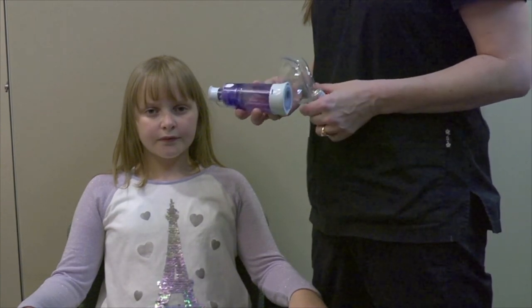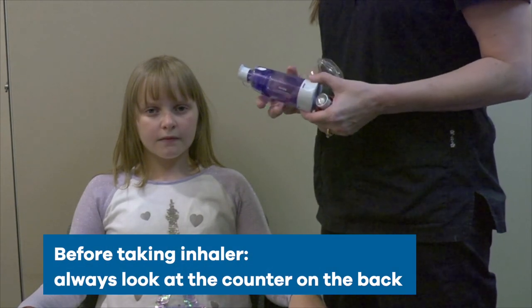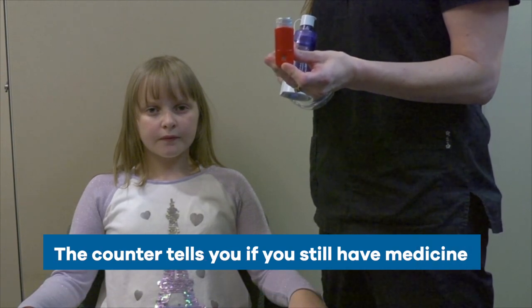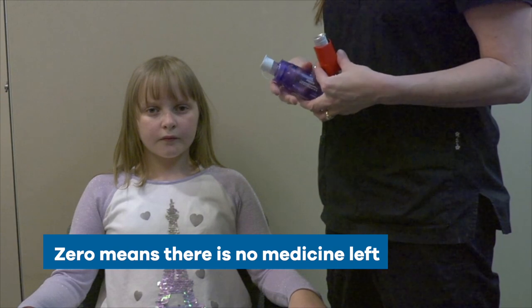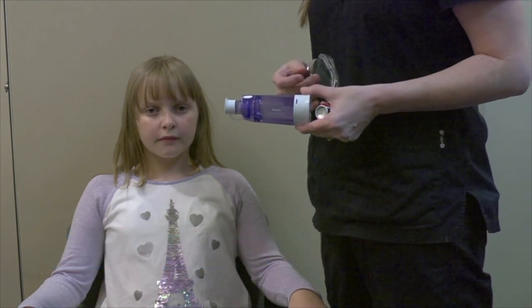We will show you how to use an inhaler with a spacer and face mask. Before taking your inhaler, always look at the counter on the back — this tells you if you still have medicine. If it is on zero, the inhaler does not have any medicine left. Even if you see a mist come out, you need to get a new one as soon as possible.